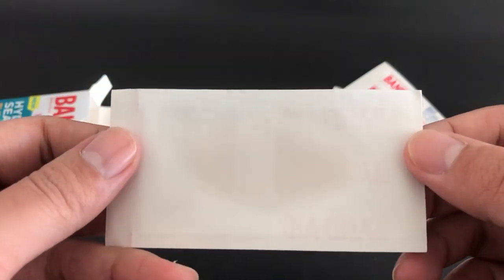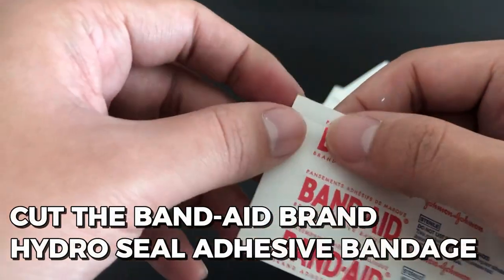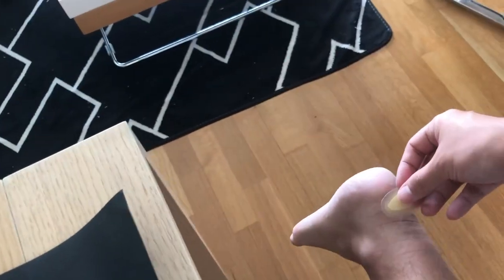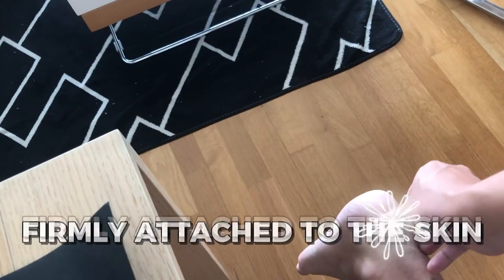In order to fit the heel blister's size and shape, cut the Band-Aid brand HydroSeal Adhesive Bandage. Apply the bandage directly to the heel blister after removing the bandage's backing.